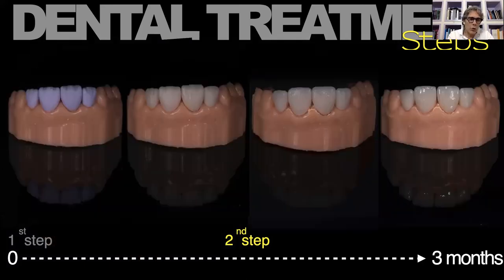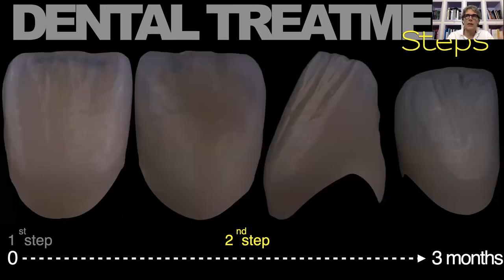Applying the concept that I have shown you before, I created the indentation on the incisal edge of the four upper incisors. After the first firing process, in order to crystallize the metasilicate into lithium disilicate, I layered only one layer of opalescent transparent ceramic, and after the last firing process, in order to crystallize the ceramic, I sculpted the texture on each surface of the four upper incisors, and I only polished, without stain, without glaze. Glaze and stain are not necessary. Only the polishing technique. It's very, very important to obtain a great final result from an aesthetic point of view.